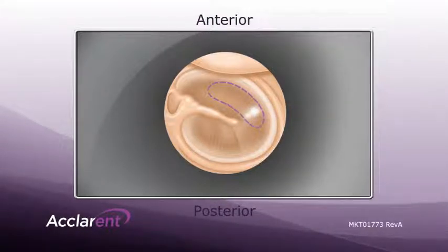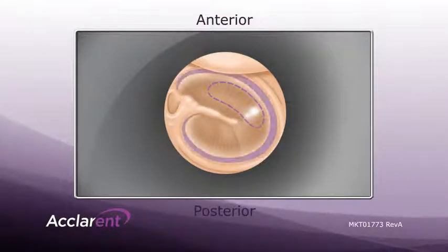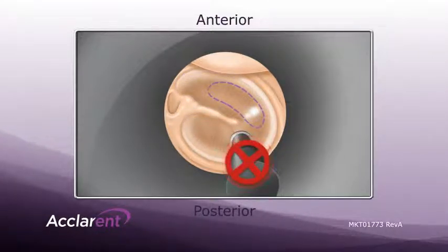Be careful to keep the tip of the device away from the malleus and annulus. Avoid the posterior aspect of the tympanic membrane.